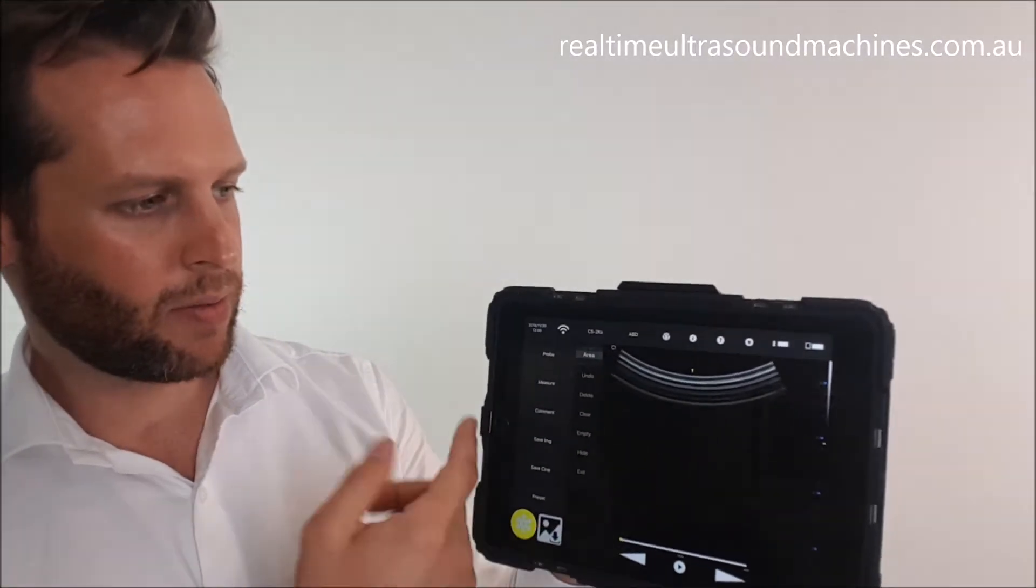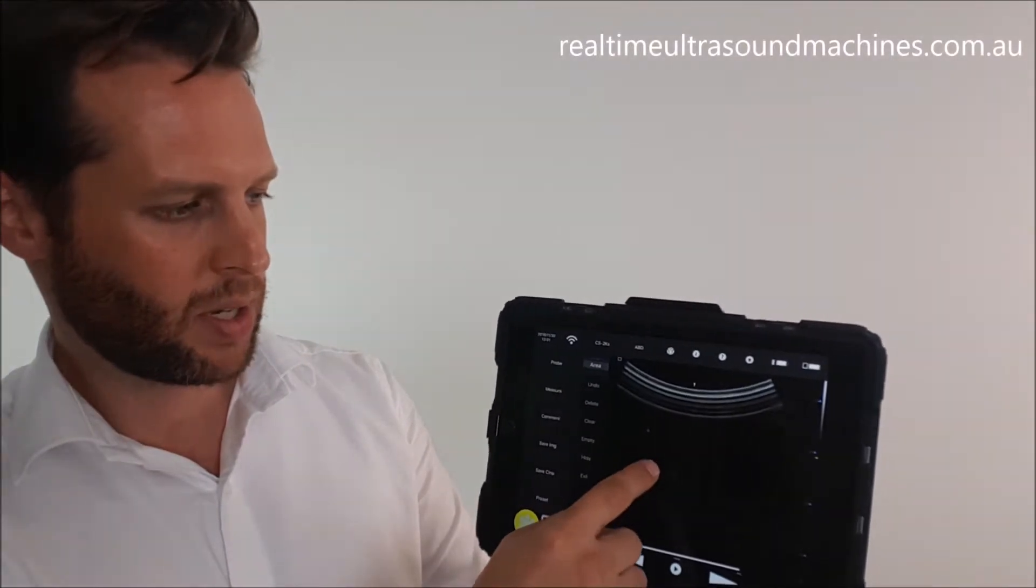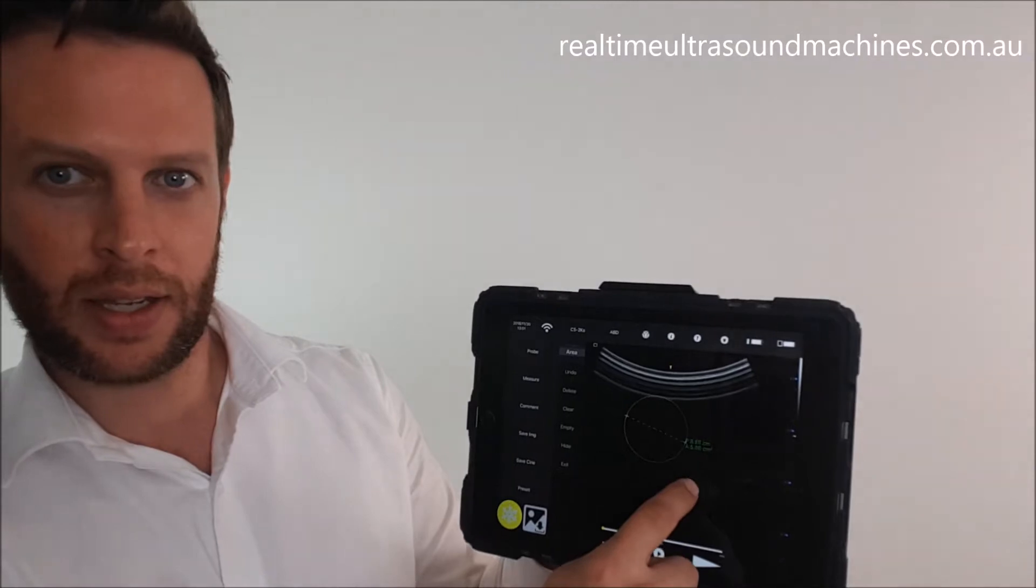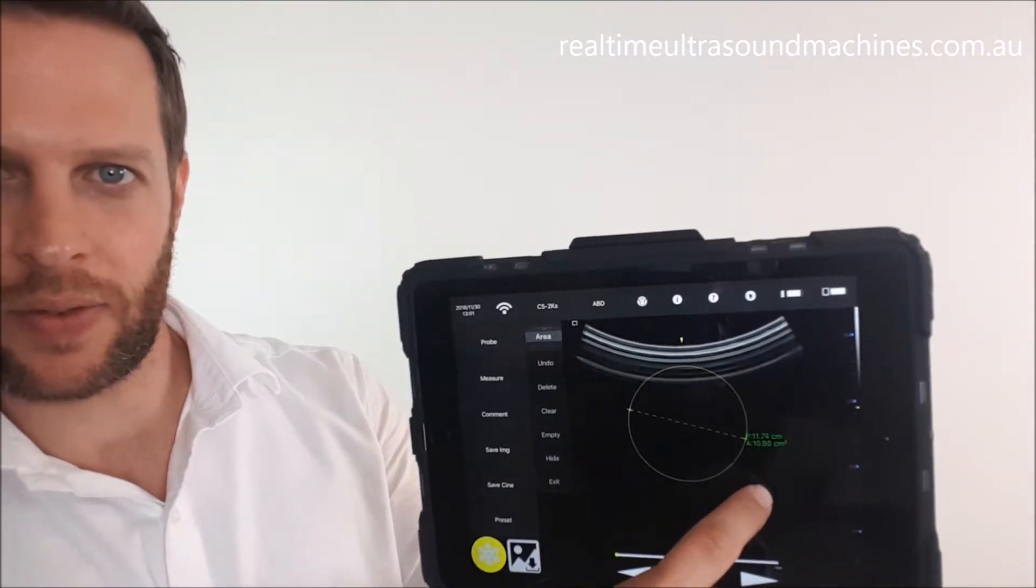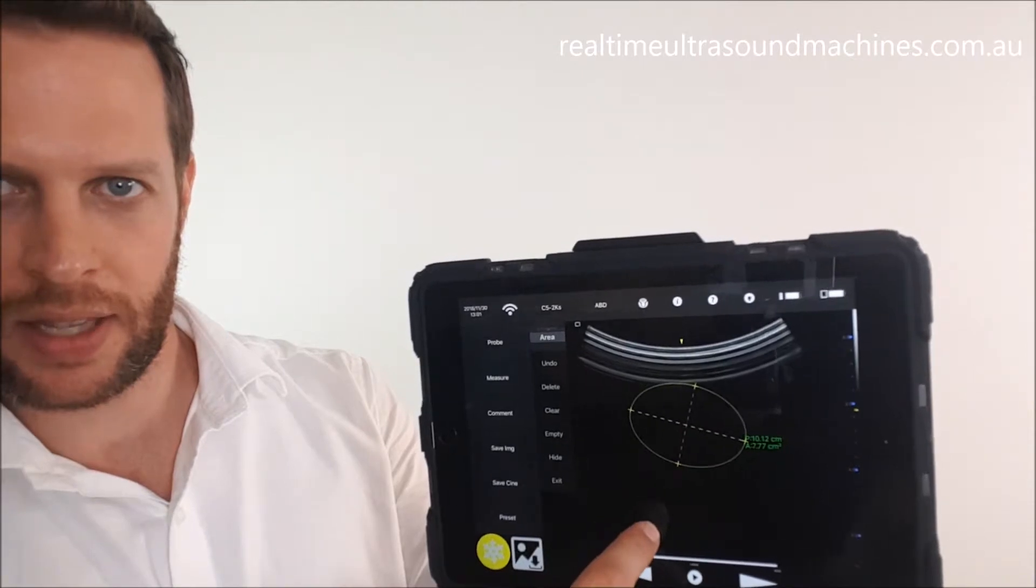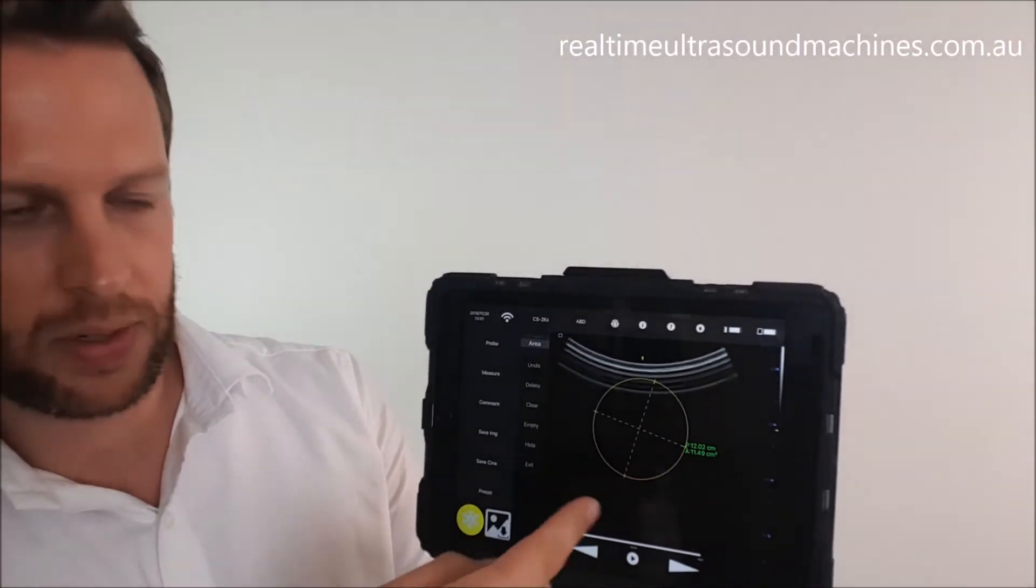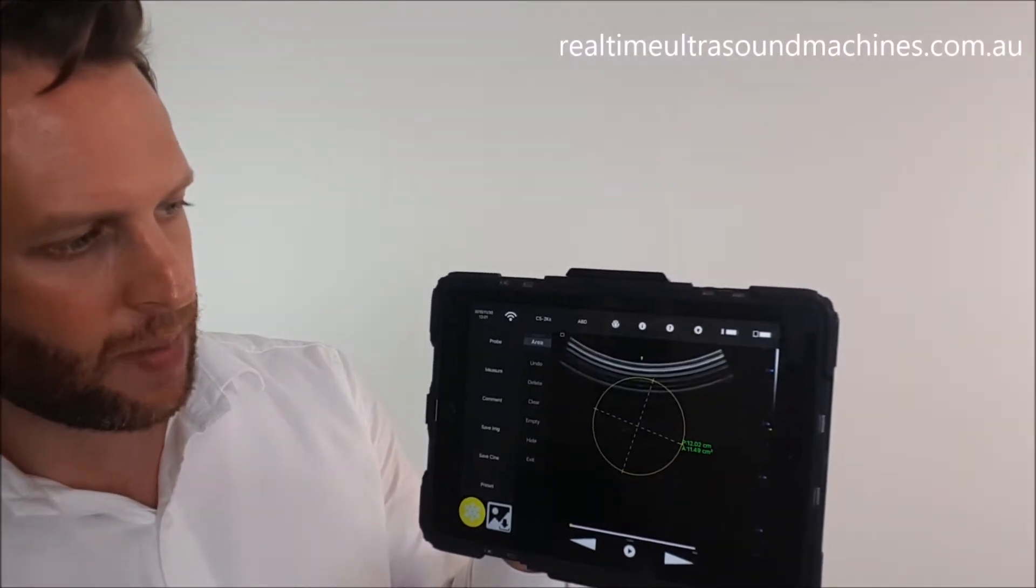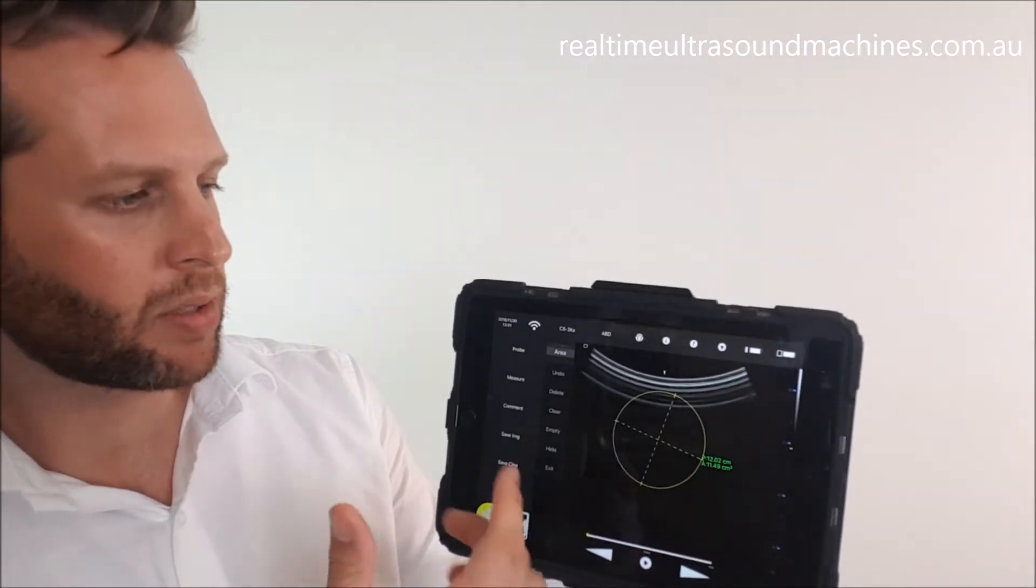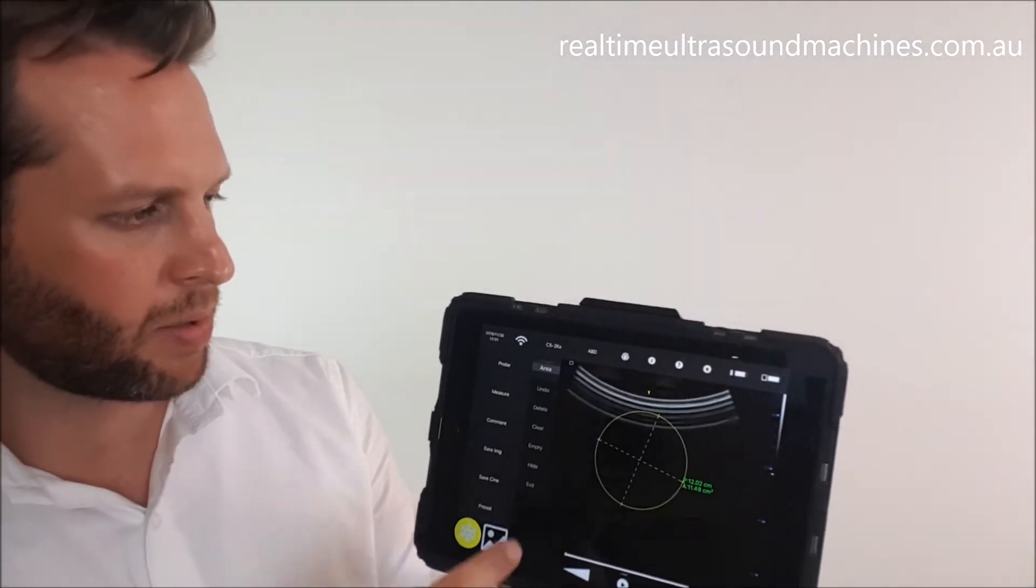If you're doing something like obstetrics, you can use area. All you do is touch the first spot, double-tap, then use your finger to bring out the sphere. Double-tap again and you can adjust the other parameters. What it's going to do is give you the perimeter (which is the circumference) and the area, so you can use the perimeter for things like abdominal circumference or head circumference.